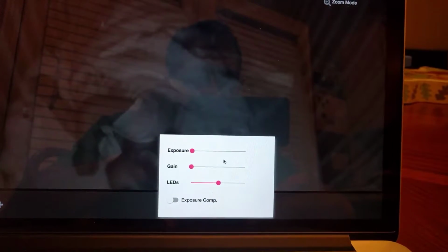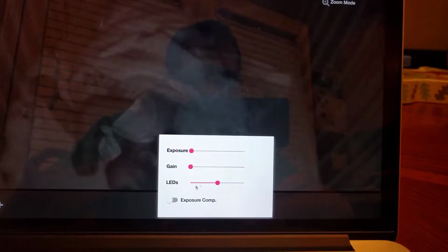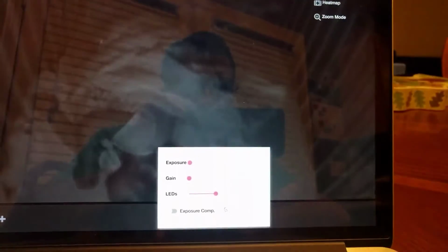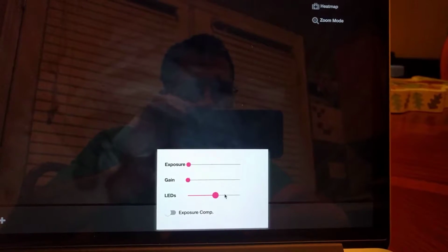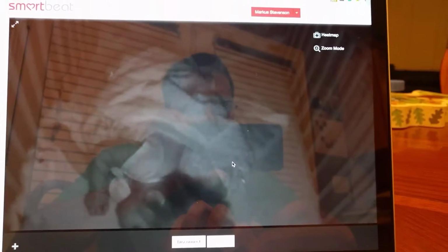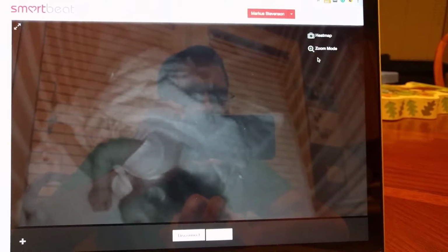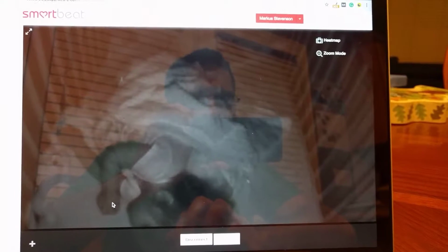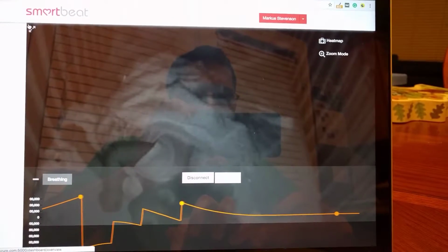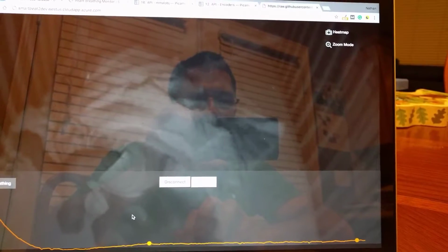First off, I know you can't really see these buttons, but there's a disconnect one. There's like a little gear icon here, and you can change things about the monitor or what kind of settings you're going to have, which I'm just going to leave the way they are right now. Well, actually, you can change the brightness of these LEDs. I'll show you that. So, yeah, in case you don't like the LEDs too bright. And I'll show you the zoom mode and heat map just a little bit later. And yeah, that's all good.